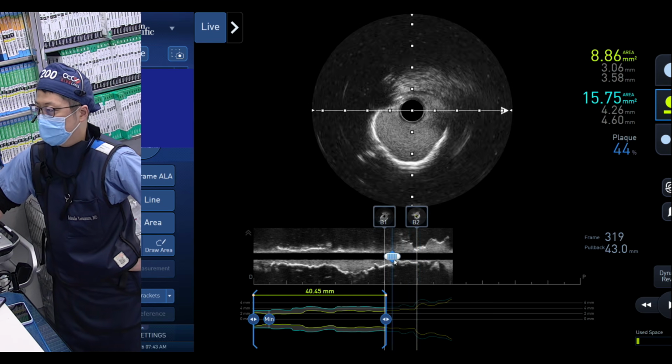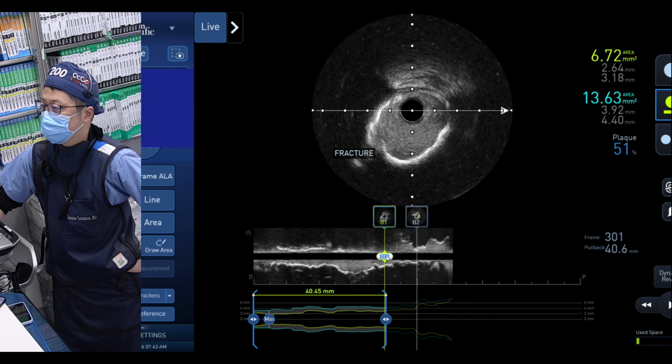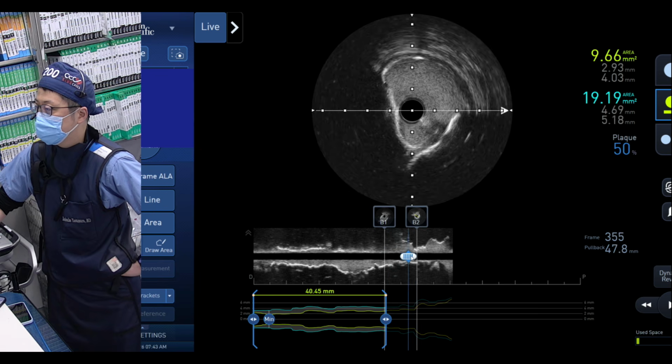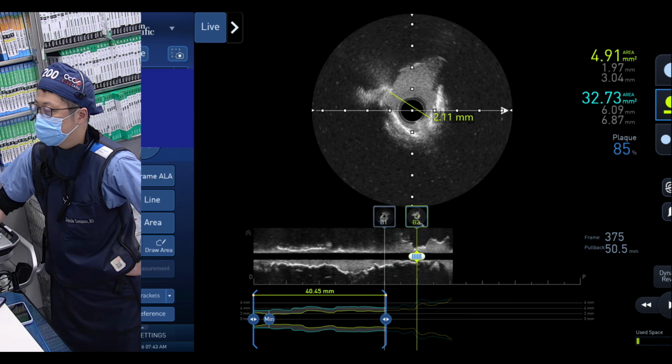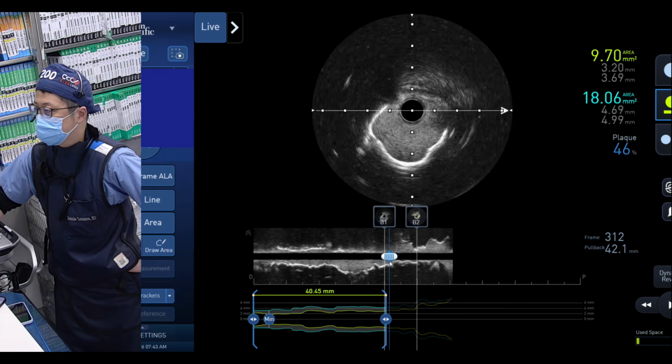You don't see a fracture, you're saying? Yeah, we saw fractures in some parts, not at the ostium. In some cross sections we see the fracture, given the IVUS resolution, but the ostium is not clear with this resolution, but the lumen is much bigger at the ostium than pre-IVL. They are not cut. So I think it's good modification.